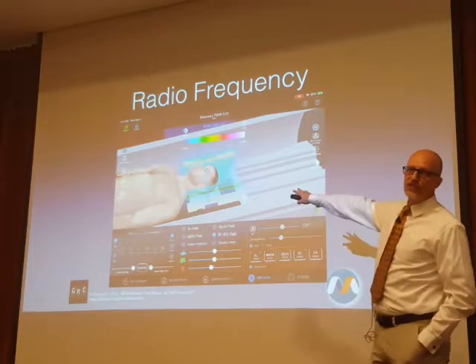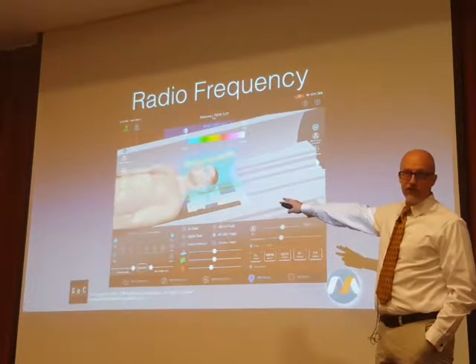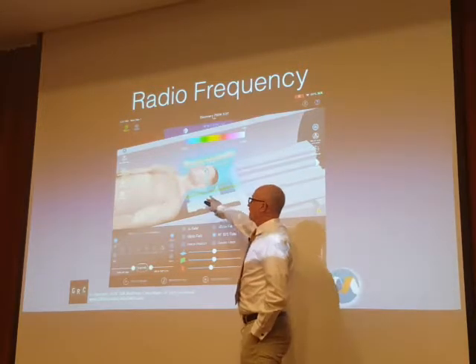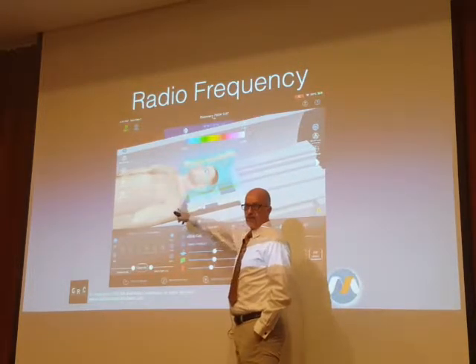If you have transmit-receive anatomy-specific coils, head coil, knee coil, take a look at this in terms of the amount of radiofrequency power.